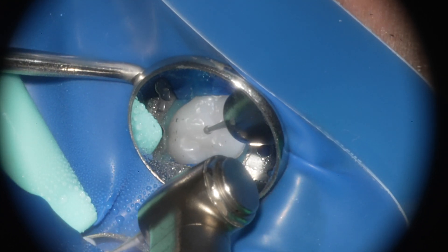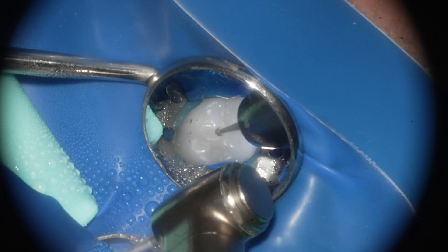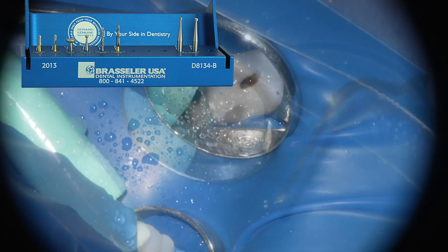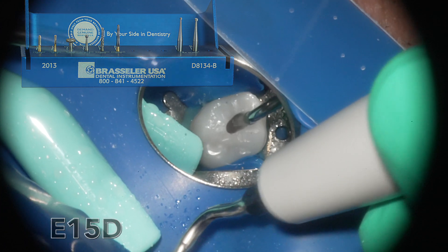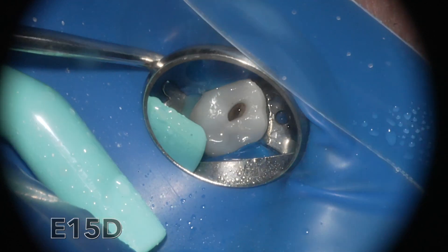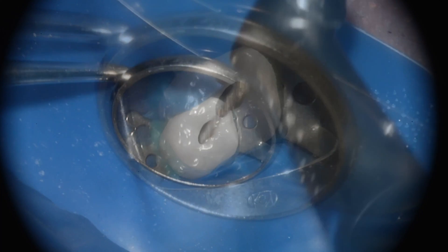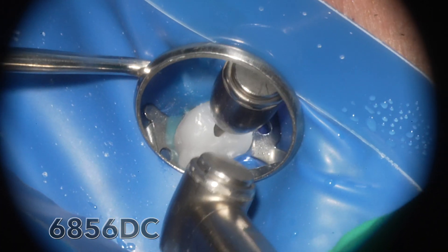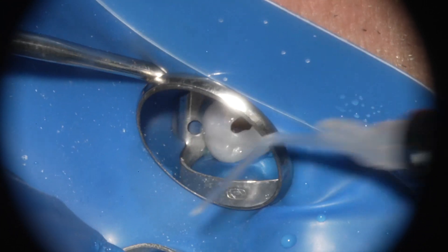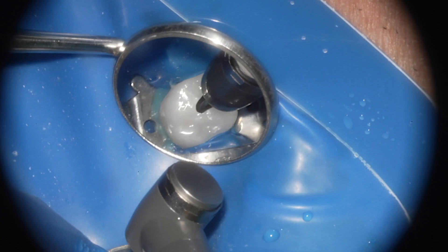This is a new zirconia crown, which is exceedingly hard, so I end up using the Duracut bur from the Modern Access Kit developed at World Endo. That's the bur used to get through the crown — it does take a little bit of time, so be patient so you don't end up cracking the tooth or crown. As you can see, we get down and there's some calcification especially where the resorptive lesion was present, so I'm using the long Duracut to give a flowing access preparation, and on the palatal canal I'm using the orifice opener.